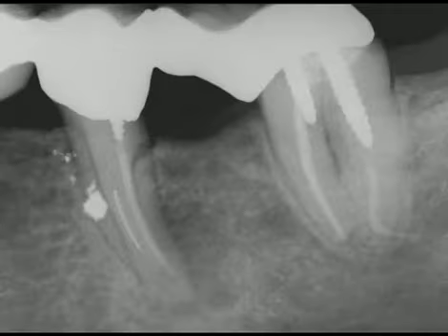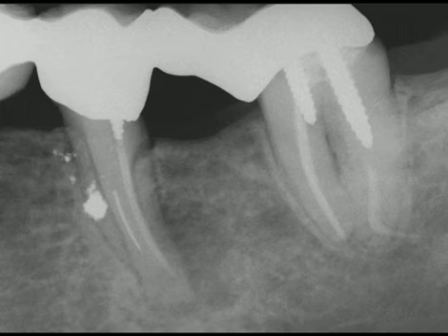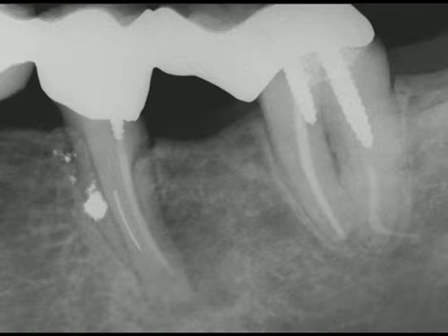Here's a preoperative radiograph of a hemisected molar, and the remaining mesial root is endodontically failing. Note a short screw post, a separated instrument, and amalgam debris from the previous surgical procedure. A clinical photograph shows the splint removed, the post out, and an ultrasonic instrument trephining around the broken file.